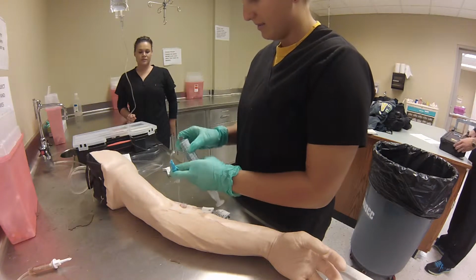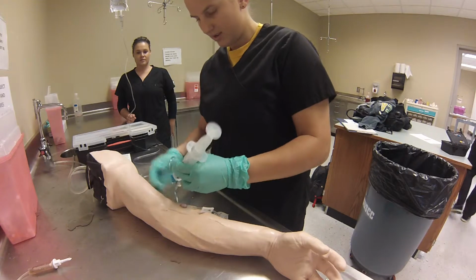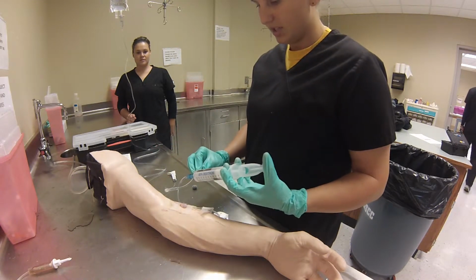All right, I'm going to confirm that I'm giving D50 25 grams. I'm going to attach it. I'm going to clamp the other end and I'm going to push it slowly.